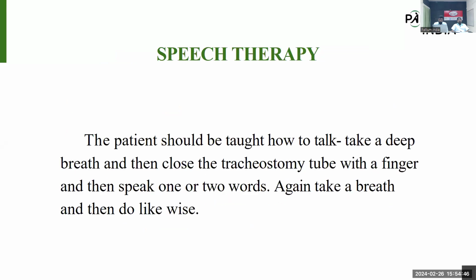Next slide. Along with the tracheostomy tube, the patient normally can't speak because the tracheostomy tube is there. But as a part of speech therapy, they can practice after closing the tracheostomy tube with one finger.